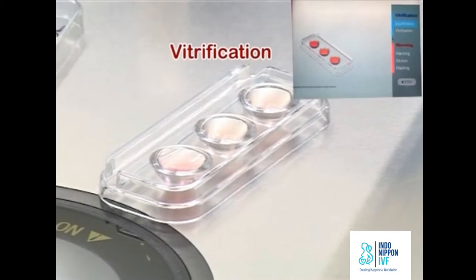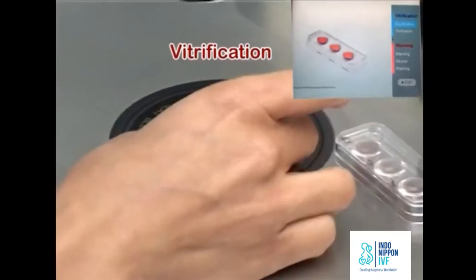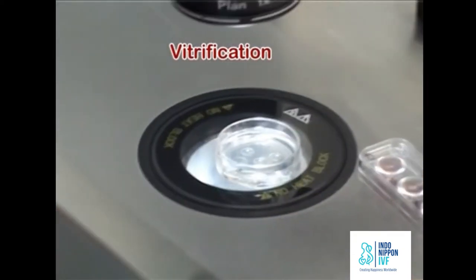Use a pipette that has the right suitable internal diameter to minimize the volume of vitrification solution. Take the culture dish containing oocyte out of the incubator.